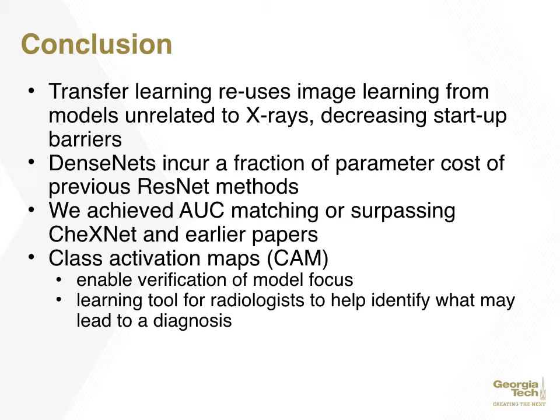In summary, transfer learning, reusing existing models unrelated to X-rays, can dramatically decrease startup barriers, allowing results equal to and exceeding trained radiologists. Heat maps enable verification of model focus and can be a learning tool for radiologists to help identify what may lead to a diagnosis.